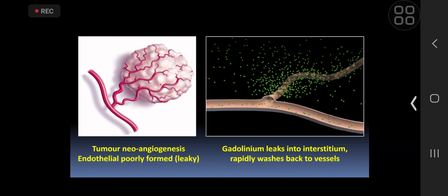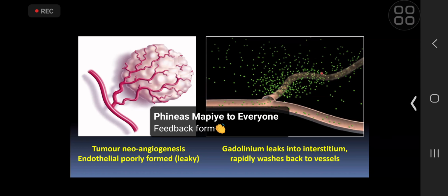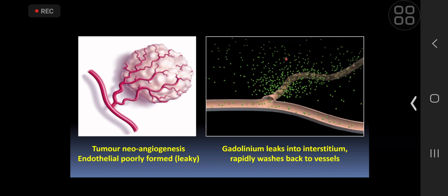They have permeable membranes. So what happens is when we inject our standard contrast agents that we use in CT or MRI, the low molecular weight agents, they don't leak out of the normal vessels, but they will leak out of these haphazardly organized tumor vessels. So we will see that as enhancement within the interstitium. So we'll see early rapid enhancement, and also they can then go back into the blood system and wash away. So we will see that then as washout.